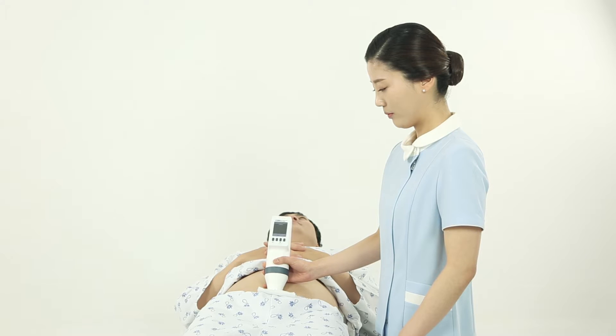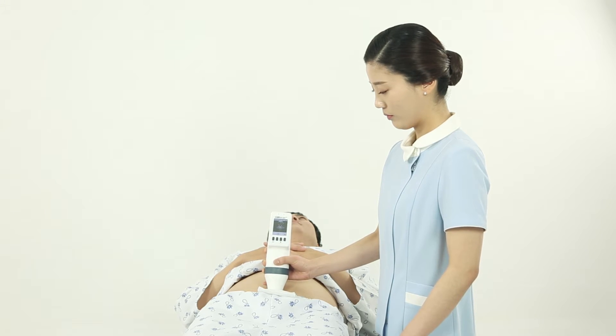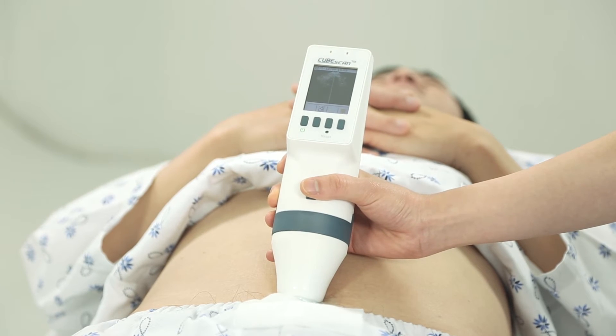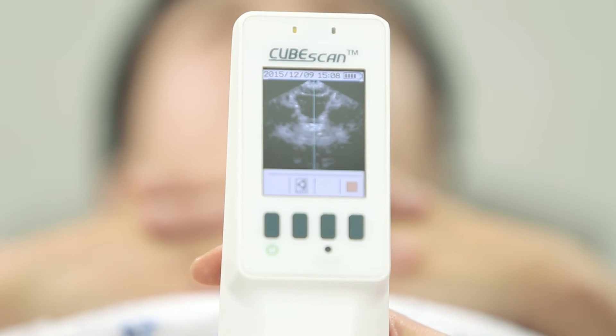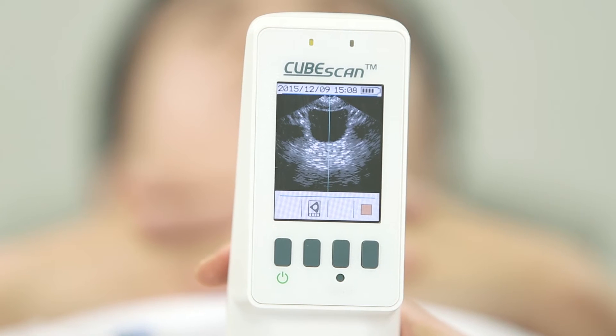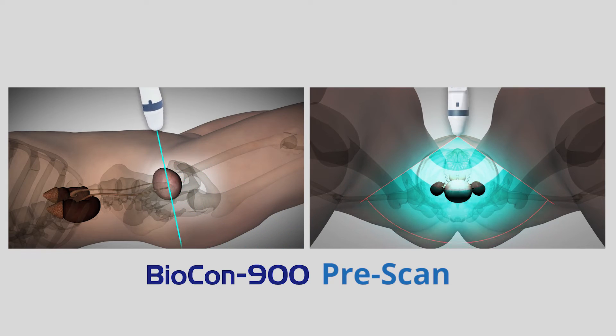Do not move the end of the probe that you have placed on the patient. Instead, angle the probe upward and downward in order to locate the bladder. Pre-scan: M-Cube's patented technology makes it easier to locate the bladder. If you slowly raise the probe from the target location towards the feet, you will be able to locate the bladder. You can refer to the illustration on the side in order to see a visual image of how to use the device.